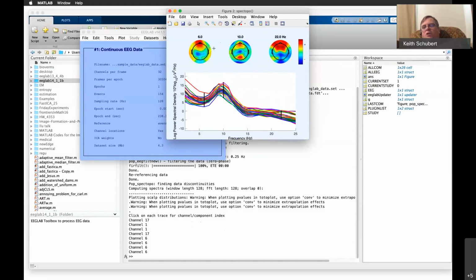They can also approximate this from some other means. On mine, it's just doing an approximation. To get these map pictures, they're having to do a full ICA on the version you have. I have an older one. This is not a perfect map. They're approximation maps. So they're not doing a full ICA. They're just doing a quick and dirty approximation.